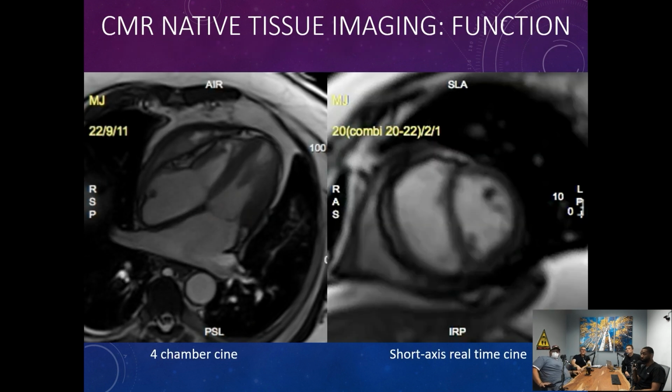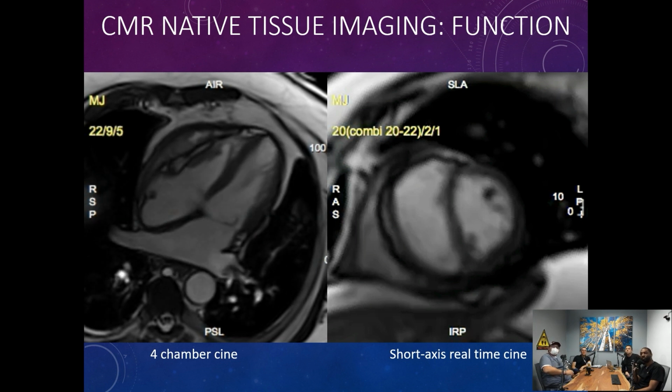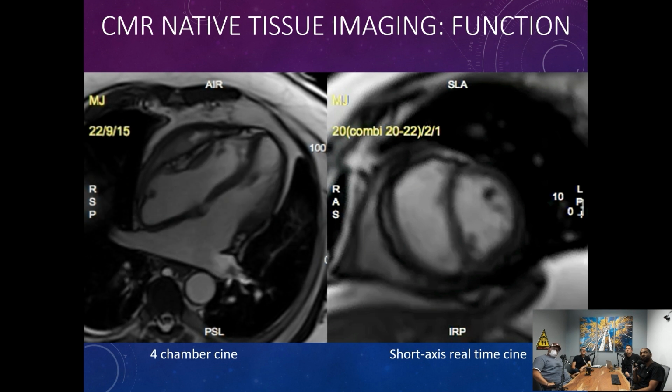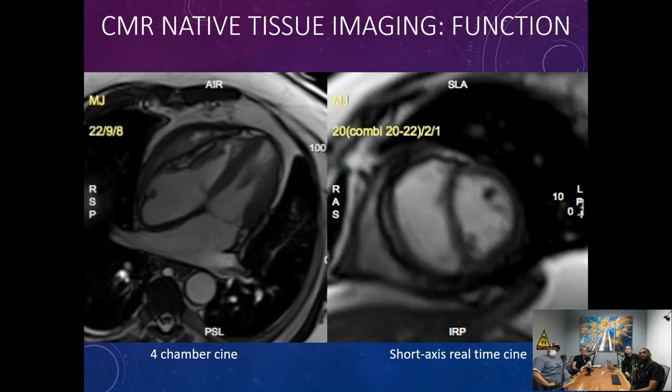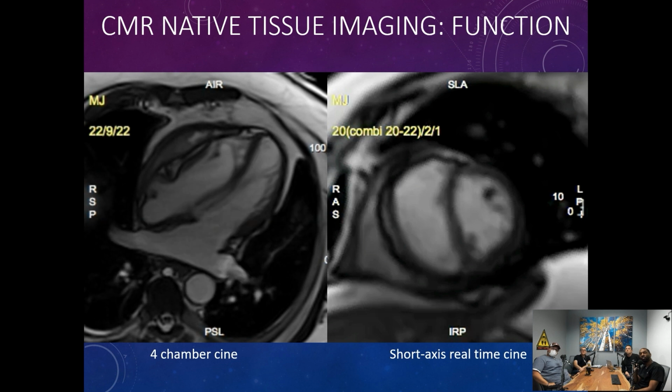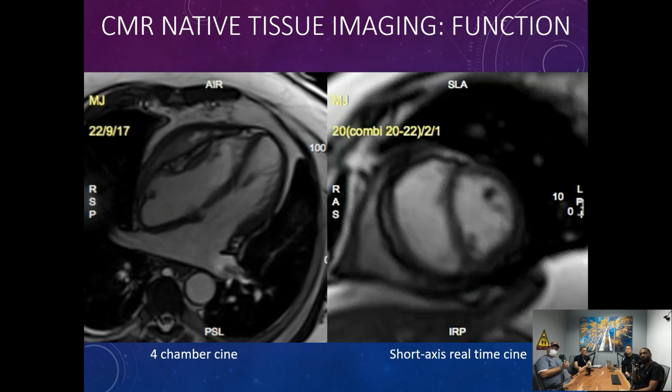No, that's fantastic. This is what has become the workhorse of our cardiac exam, because the heart moves, as we said earlier. Right. So the image on the left is a cine, basically a white blood imaging, SSFP, steady state free precession, where your repetition time is about 200 times faster than a spin echo. So blood doesn't have time to escape the slice. It gets caught and returns the signal.